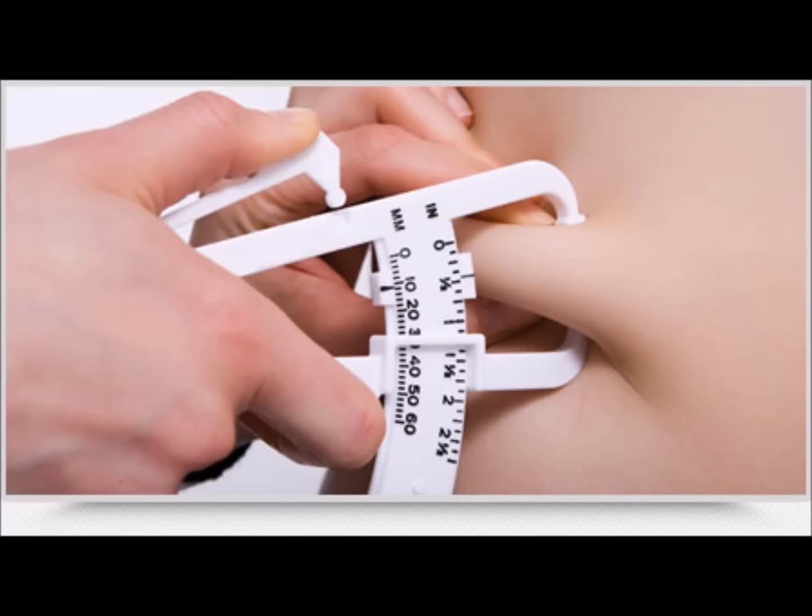Read the caliper within half a second, taking duplicate measurements. When doing so, rotate through measurements to allow the skin to go back to normal thickness and texture.